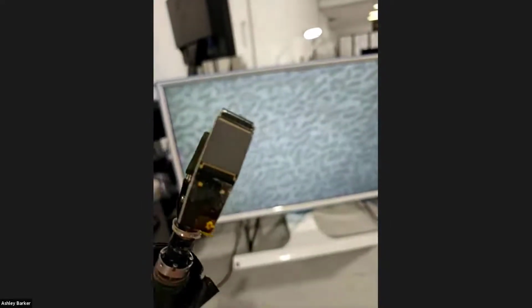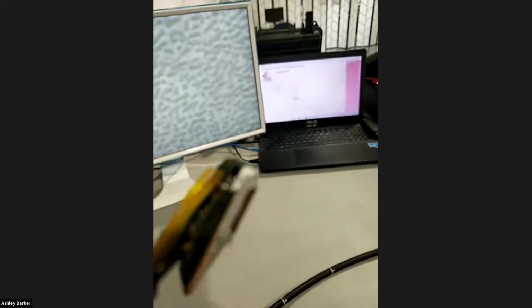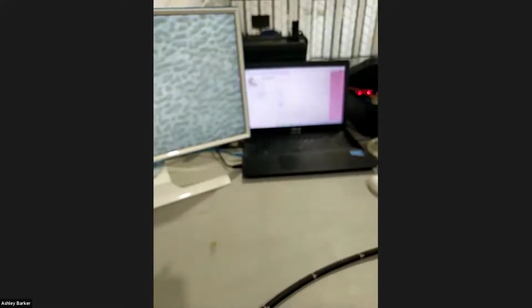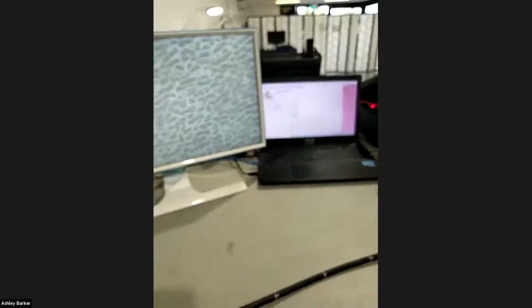And so you can see that gets you away from needing to have that spinning array, because you can just steer it all electronically. And in the end of that are some very, very tiny wires. So if it ends up getting water in it, you've got to get it sorted right away. Otherwise, it's going to corrode those wires and then it's throwaway. So it's just nice to see.